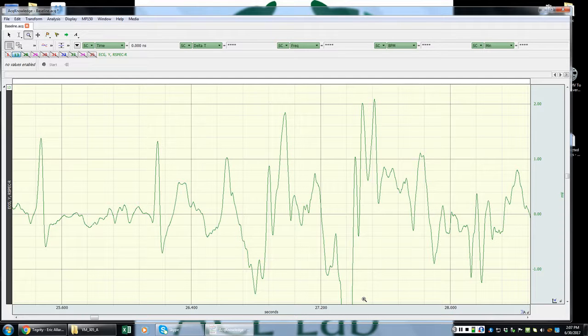So what I'm going to be doing here is trying to find, within this little range, where I think my R peaks should be located. The first thing I'm going to do is look again at the shape of the wave. So this is the shape of my R peaks.